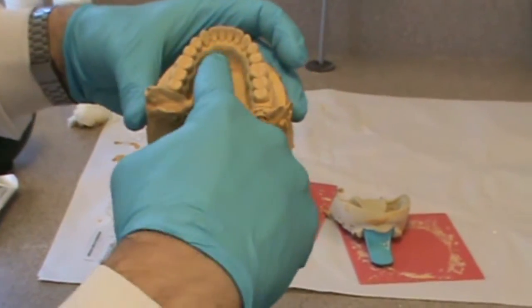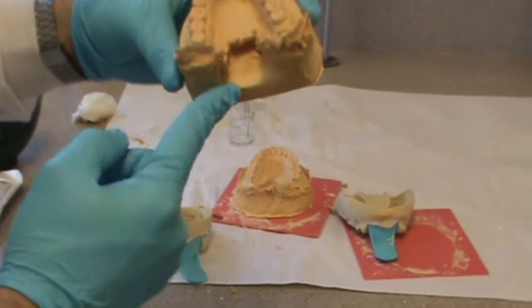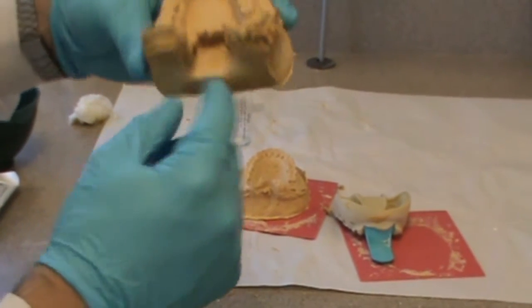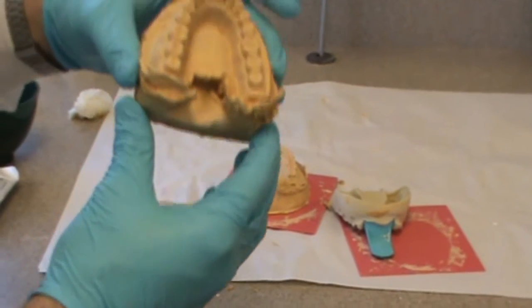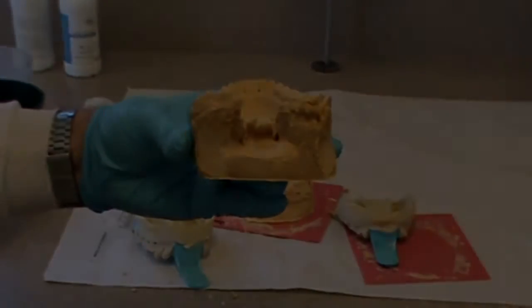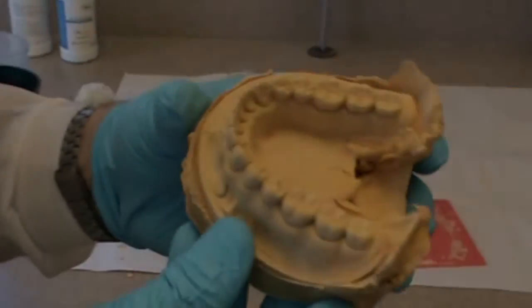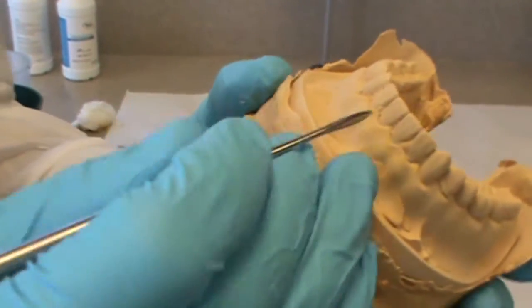Here in the lingual area, I didn't fill the stone up all the way to the lingual of where the impression was. So I'm going to fill that in with a little bit more stone in the second step. I'm going to fill that area in.